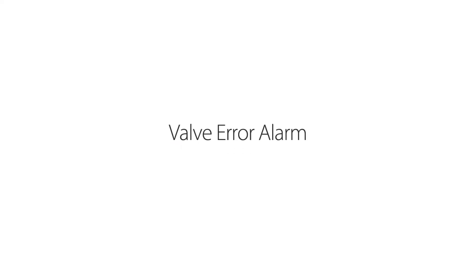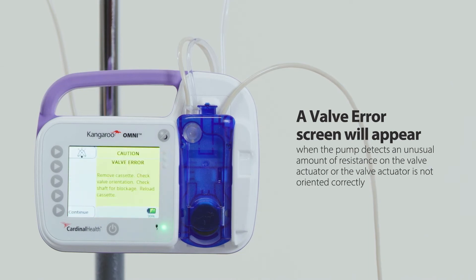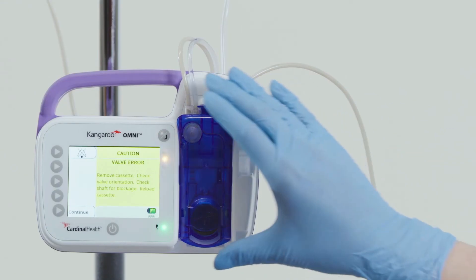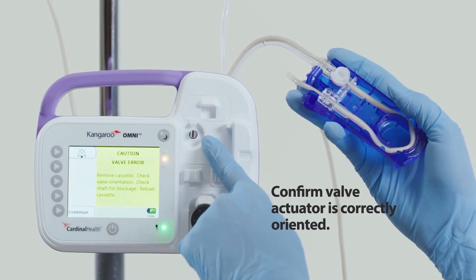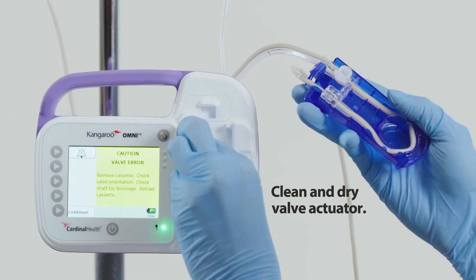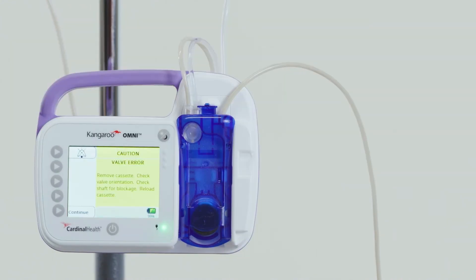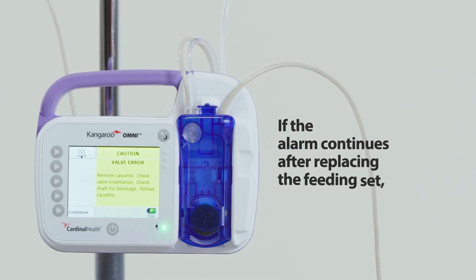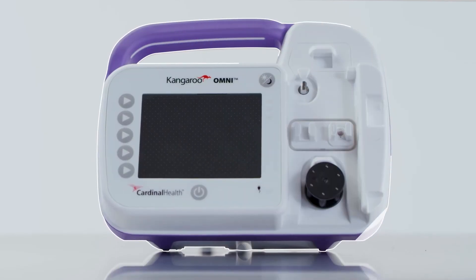Valve error alarm: a valve error screen will appear when the Kangaroo Omni enteral feeding pump detects an unusual amount of resistance on the valve actuator, or the valve actuator is not oriented correctly. To resolve the alarm: first, unplug the pump from the electrical outlet. Second, remove the cassette. Third, check the valve actuator for blockages. Fourth, confirm the valve actuator is correctly oriented. Fifth, clean and dry the valve actuator. Sixth, reload the cassette. If the alarm continues, replace the feeding set. If it still continues, press power off and use a different pump.